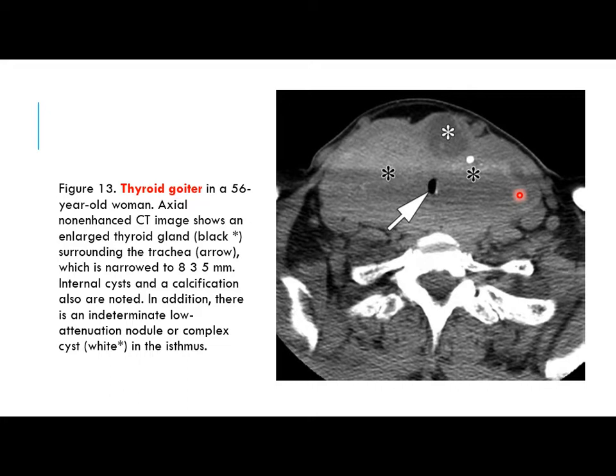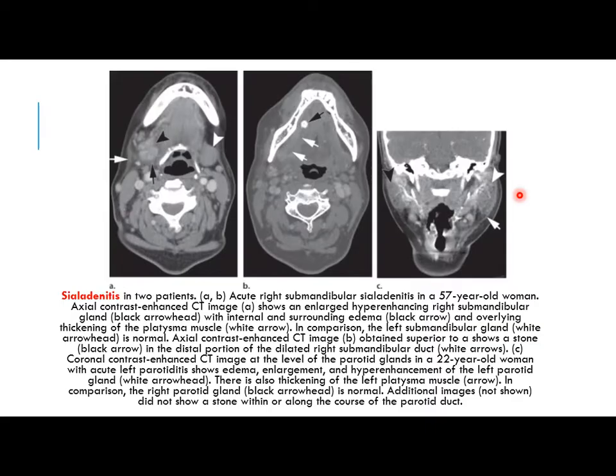So we measure the extension of the thyroid gland in this way. Actually, the thyroid gland is encapsulated, so it's rarely associated with fat stranding, unless there is, as we said, rarely underlying abscess formation that may lead to inflammatory change surrounding the thyroid gland.